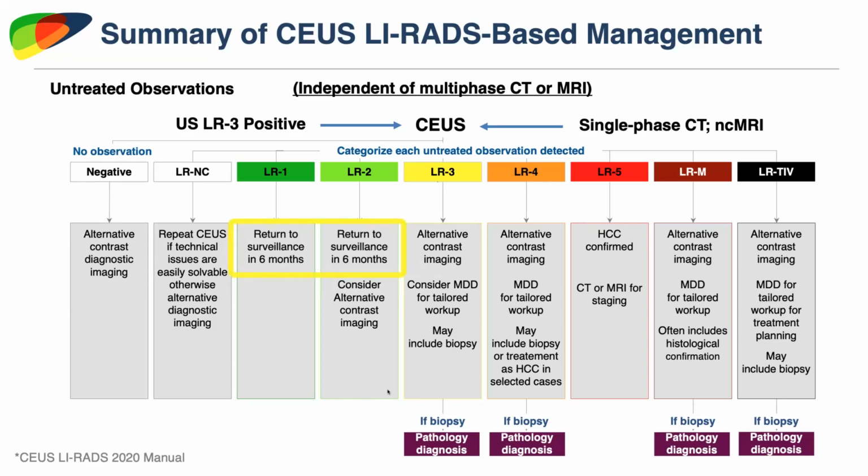And the benefit here is that if we turn out to be able to diagnose an LR1 or LR2 observation or even LR5, then the diagnostic pathway is essentially done. And in areas where contrast-enhanced ultrasound may be more cost effective, maybe safer, maybe better tolerated by the patient, then this modality can play a very important role in this workflow.